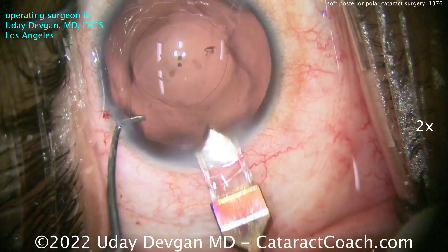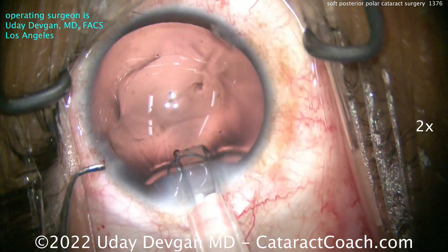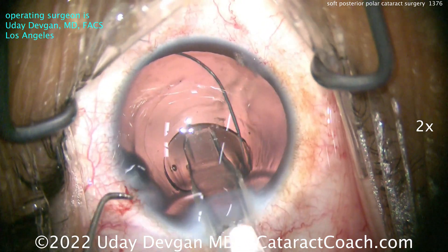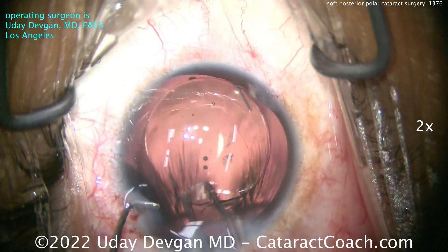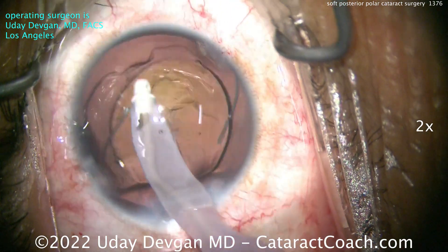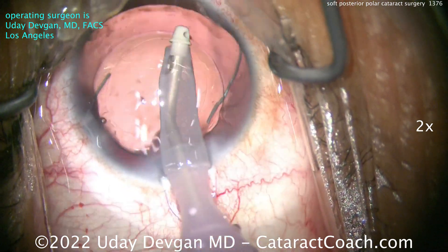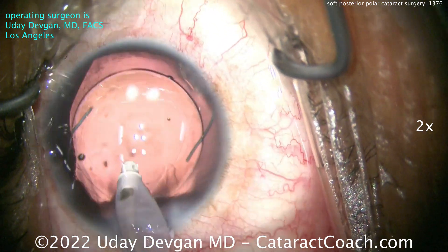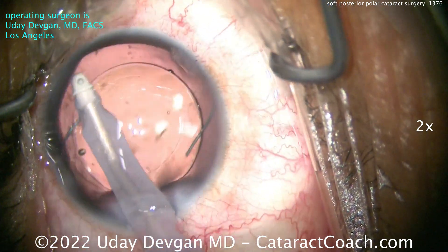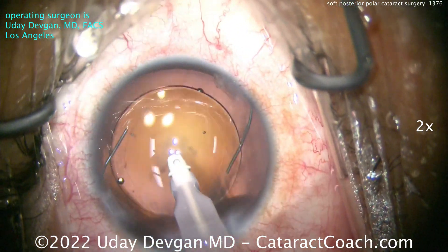I'm going to slightly enlarge the incision here. This patient has a very strong need for a non-reflective IOL because of the line of work — the patient is on camera a lot. So the IOL goes in the eye: a three-piece monofocal silicone lens, put in nice and easy. The beauty is there will be zero reflections, no matter how close up the camera is. The other nice thing is that if there is a break or problem with the posterior capsule, I already have a three-piece lens in the eye — I can dial it into the sulcus, optic-capture it, or reverse optic-capture it. It's far more versatile than having a single-piece lens in the eye, and of course there will be zero reflections from this lens.